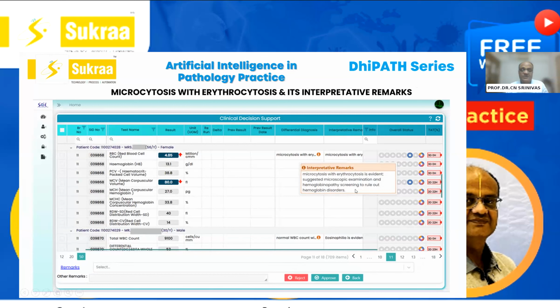As we said, we have to screen both the RDWs and the MCVs to differentiate between iron deficiency anemia and the thalassemias. Here you have the MCV low and the RBC high, though the hemoglobin is around 13.1, and they use clinical decision support system algorithms based upon the international guidelines. It's not that the data and artificial intelligence have been done arbitrarily. It has traceability to the international guidelines also.